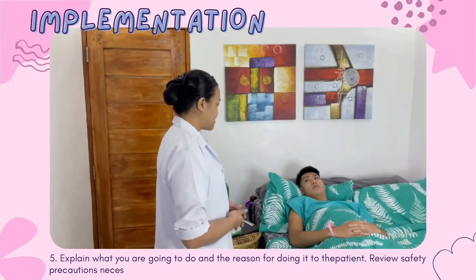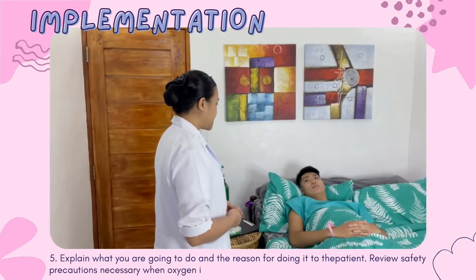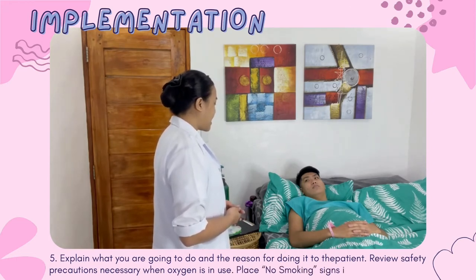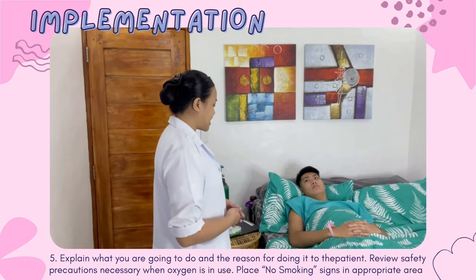Good morning, sir. Good morning. I'm Anna Maria Eligio, a student nurse from NEST. And for today, I will demonstrate how to administer oxygen via nasal cannula, okay?